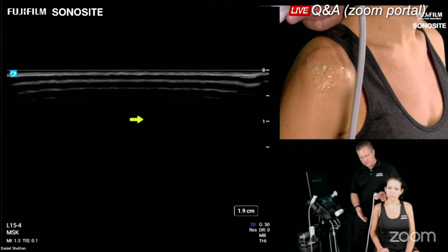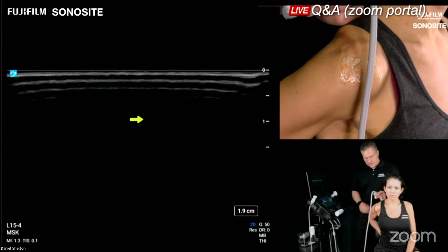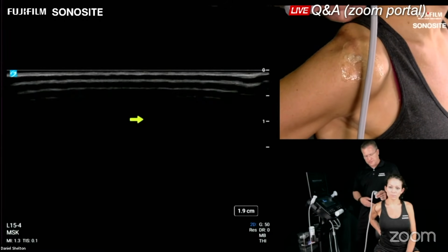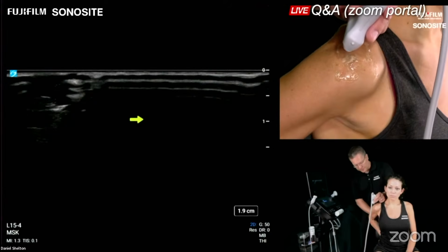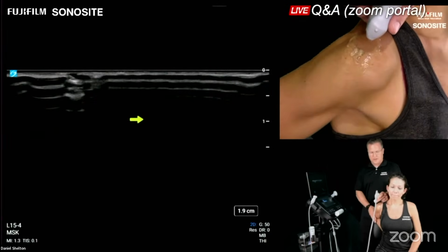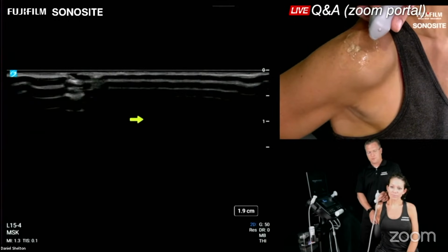And what I'm going to have our patient do is go into modified CRAS, which is the palm in the back pocket. If your stool doesn't have a backrest, that's a plus. If they do, sometimes they just have to scoot to the front of the stool. But if your patient's comfortable in this position, it's going to be just fine. Actually, I'm going to have you scoot up just a touch. There we go. And the reason for that is we're going to be moving the elbow just a little bit, and we want that free room back here.